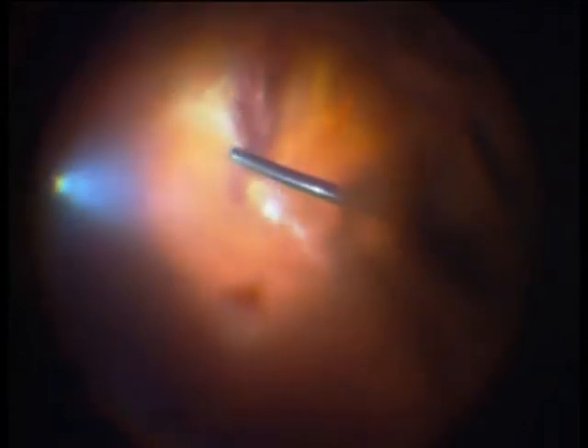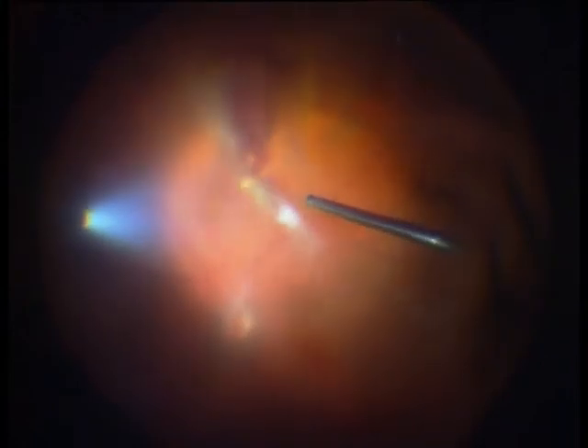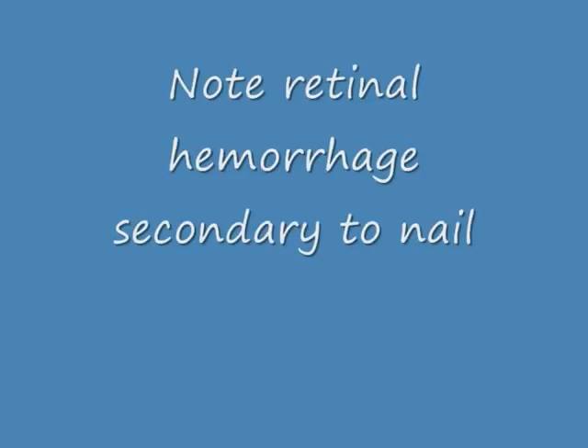Here you see a retinal hemorrhage — this is where the nail perforated the retina, at the 12 o'clock position. And down here is another hemorrhage of unclear origin at the 6 o'clock position, in relation with the nail perforation.